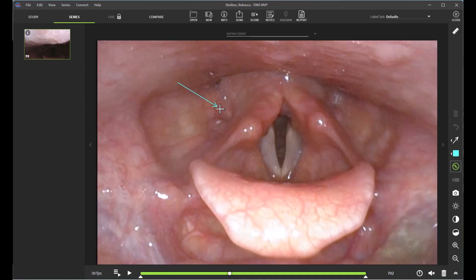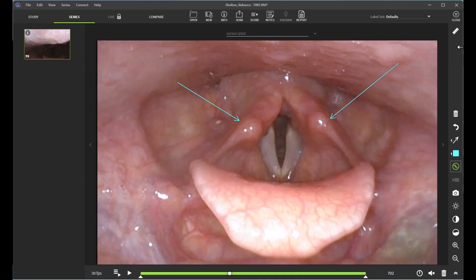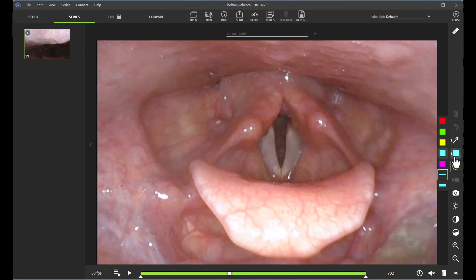Let's say I'm going to point out the arytenoids — I can easily do that, and I can label them if I want, or just leave it as is. And if I'm wanting to make them a little bit easier to see, I might change the width.